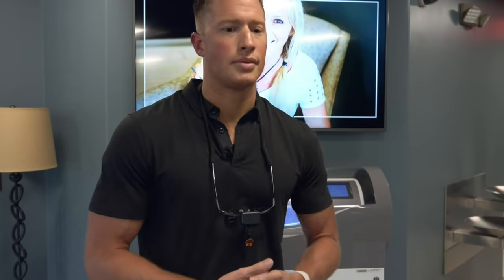I could have maybe squeezed a 5.0 in there, but a 4.3 is definitely sufficient. So when you're talking about space or strength, it really depends on the size of the implant, placing the proper size. And if you place the proper size, I don't know the exact number of implants I've placed, but I have had zero fractured implants. No fractured titanium, no fractured porcelain, and it's well over 500 implants at this point. So that's a good factor, right? Teeth obviously break at a much greater rate than that. So the likelihood of titanium and porcelain as thick as we're able to make it on top of an implant breaking is really, really slim. I would say probably the only thing that's going to really cause an implant to break would be an accident, a trauma victim, somebody who had a car wreck, something like that. But otherwise, I don't see that happening with natural forces.